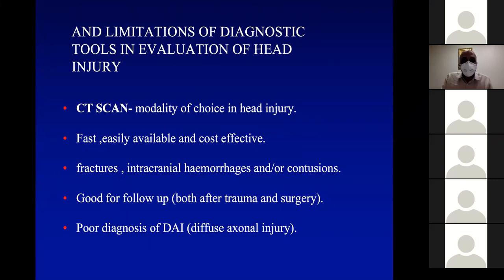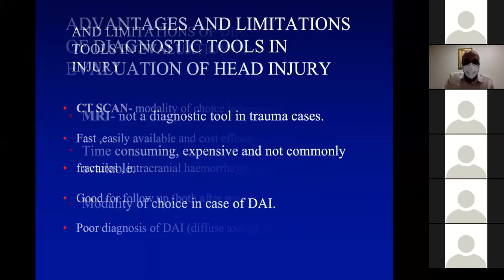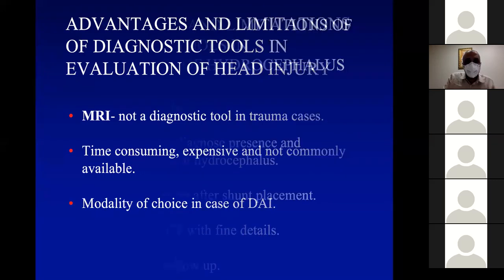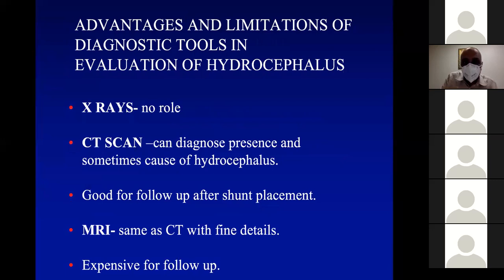We've already dealt with head injury again. Evaluation of hydrocephalus. X-rays has no role. CT is important, can diagnose presence and sometimes cause of hydrocephalus. It is good for follow-up after shunt placement. MRI provides similar details, but it is more expensive.